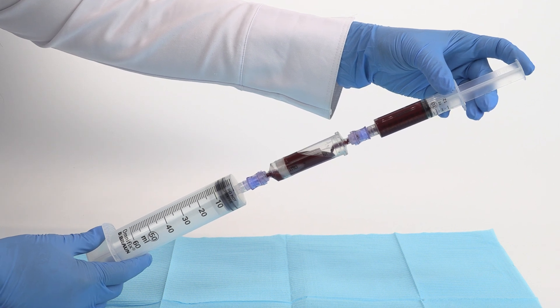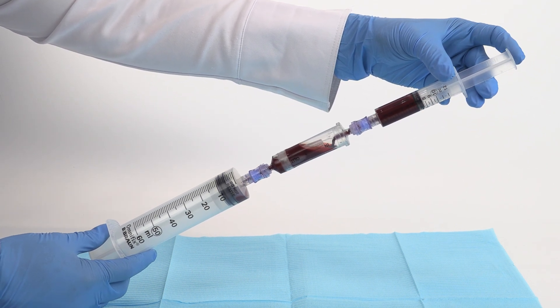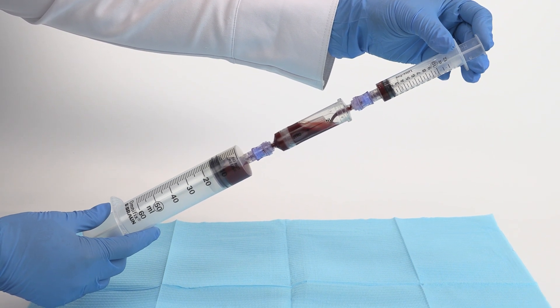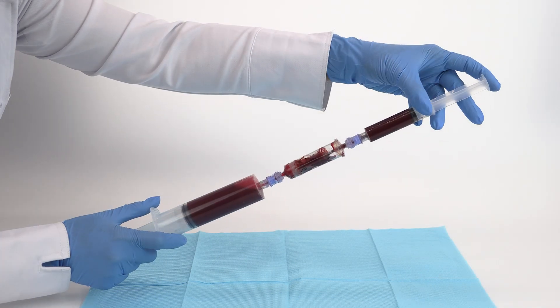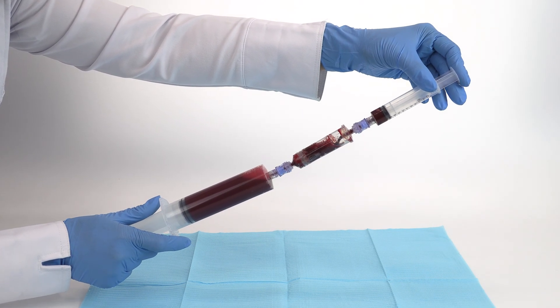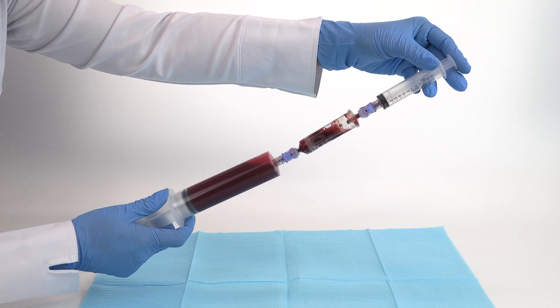Connect each 12 milliliter bone marrow syringe to the import of the bone marrow filter, then connect a 60 milliliter syringe to the outport of the filter. Filter by injecting the bone marrow from each 12 milliliter syringe through the filter into the 60 milliliter syringe.